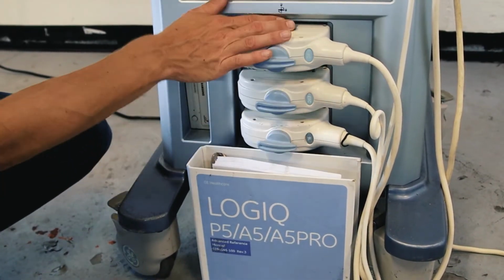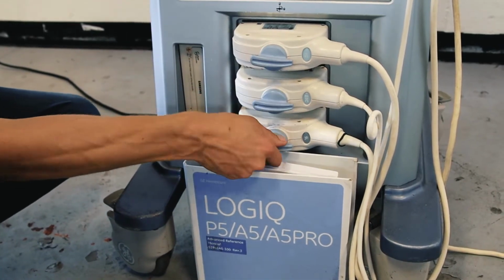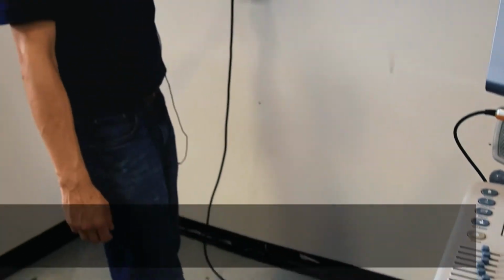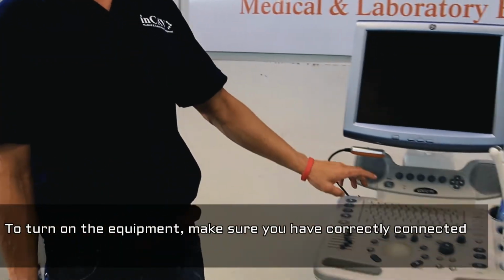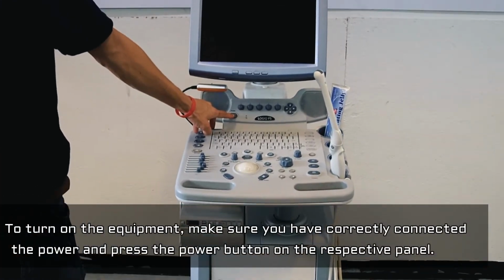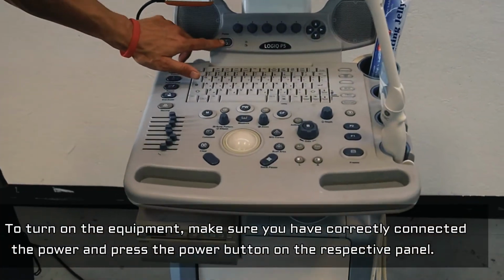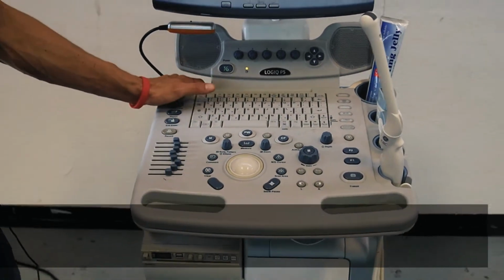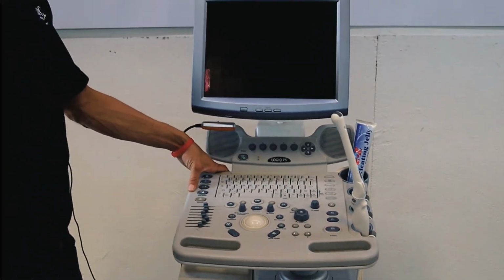Once you have everything plugged in nicely and locked, you can come over and put the power to it, of course. And then all you have to do is come over here and hit this power button located at the top left of the control board. Within a few moments, once it's gone through the boot up cycle, it should be ready to use.